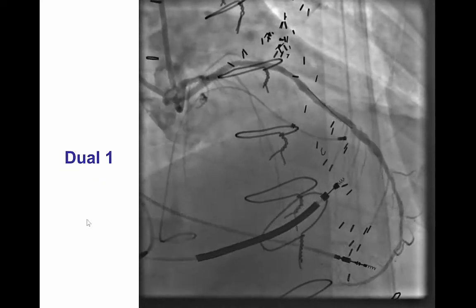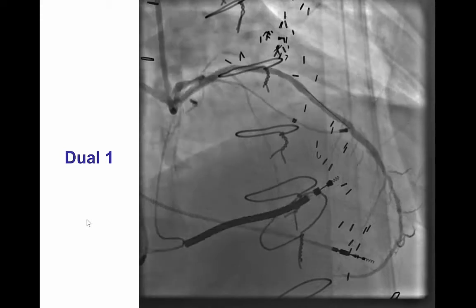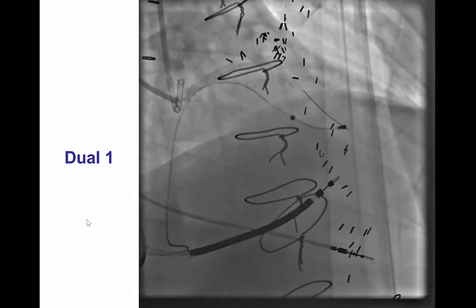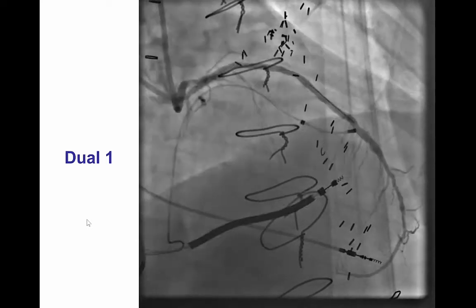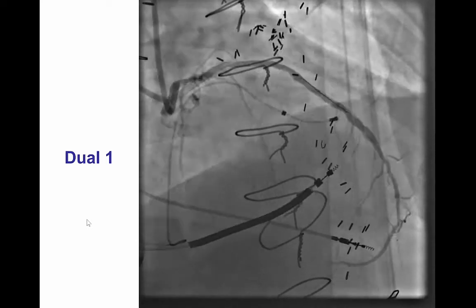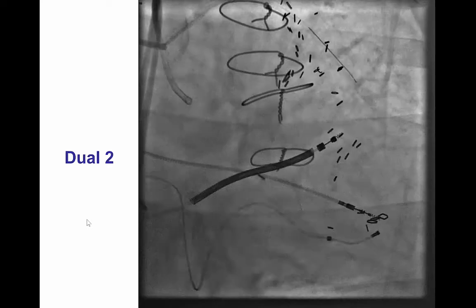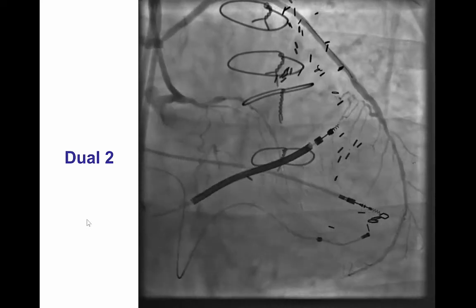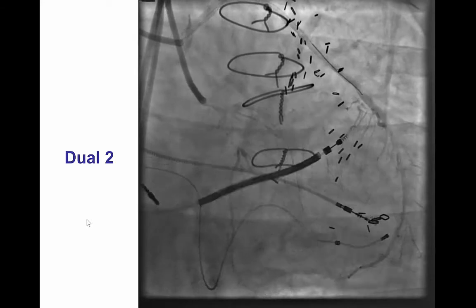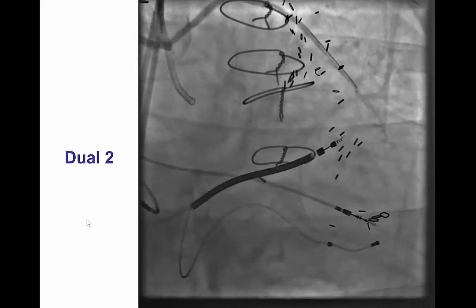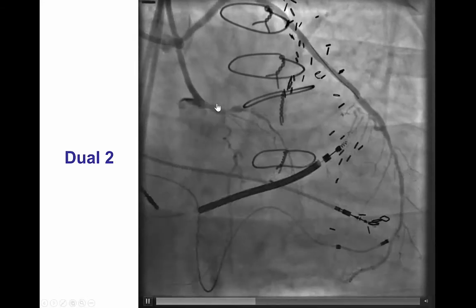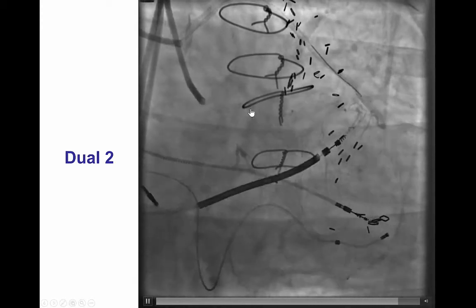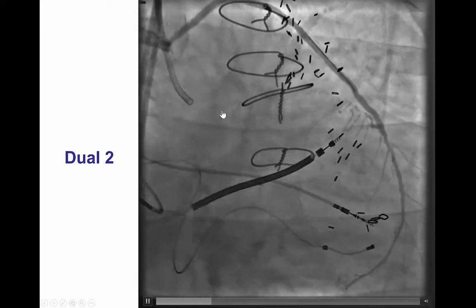Given the multiple restenoses of the saphenous vein graft, consideration was given to recanalizing the native LAD to avoid further problems with restenosis of the vein graft. To do this, we performed a dual injection from the left main as well as the vein graft to the LAD. What we saw was an LAD CTO with an ambiguous proximal cap and a small septal coming at the proximal cap.